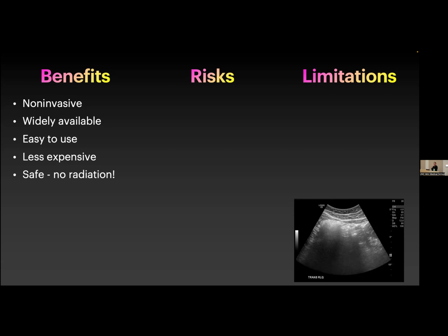Safe, right? We have no radiation associated with this imaging, and we have real-time images. So the great thing is on ultrasound, if we're not sure what the images are showing us, we can go back in and take more pictures. On a CT or an MRI, we try to time it, especially if you're giving contrast through your IV. We time it to see where that contrast is going and how quickly I need to image so I can see where that contrast is going.